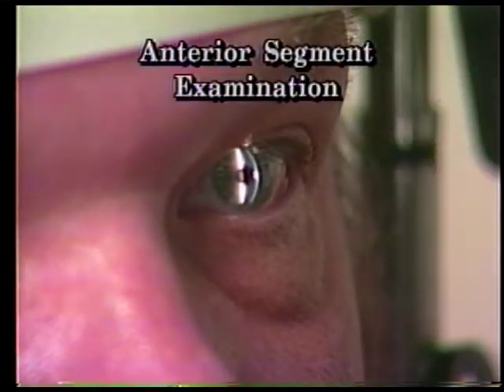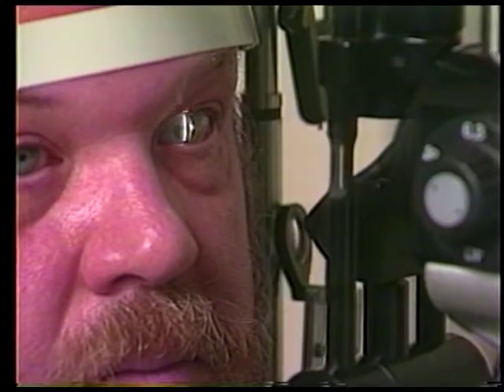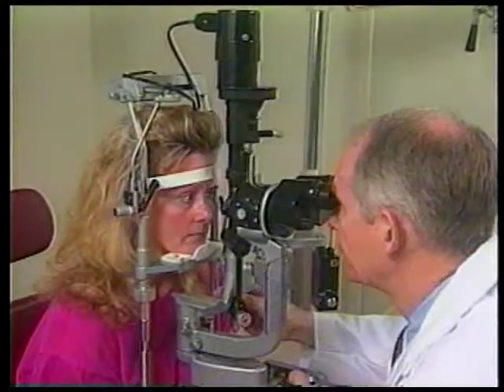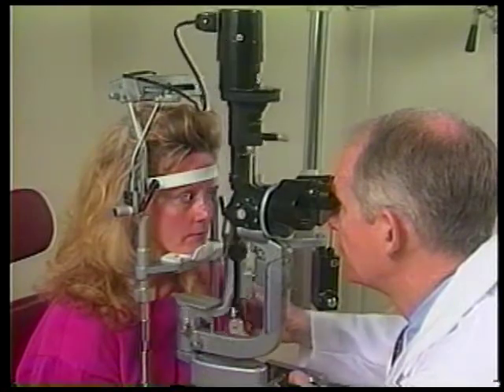Begin your anterior segment examination by sweeping the narrow slit beam across the cornea while looking at its various layers and their reflections. The slit lamp is particularly well suited for studying the details of the cornea, anterior chamber, iris, and lens. Certain slit lamp manipulations make anterior segment examinations much more revealing and rewarding.